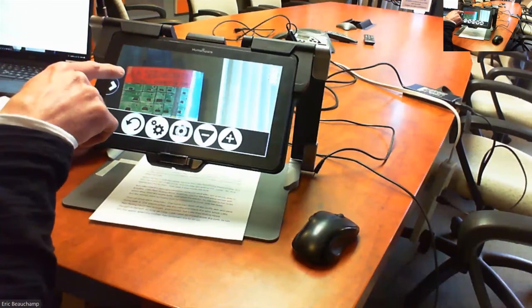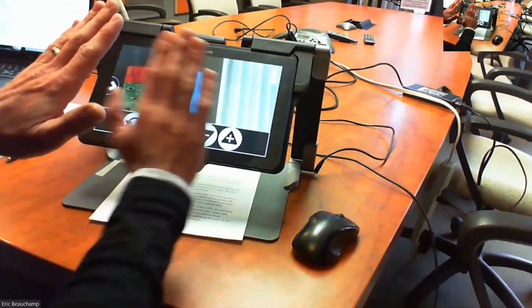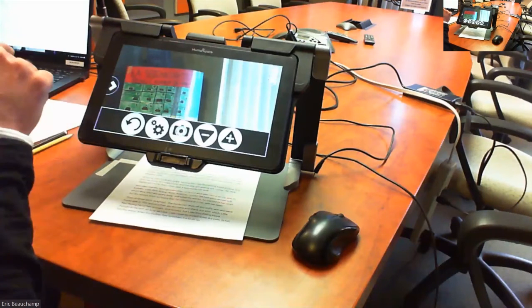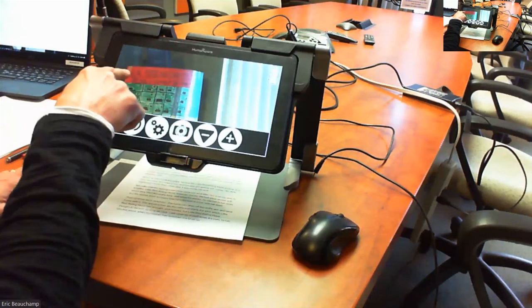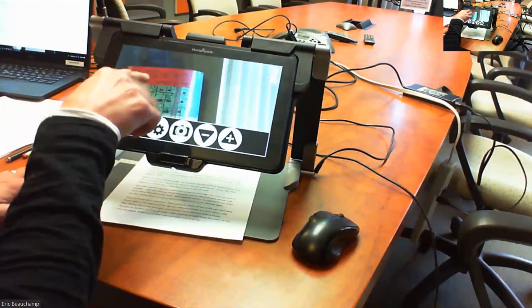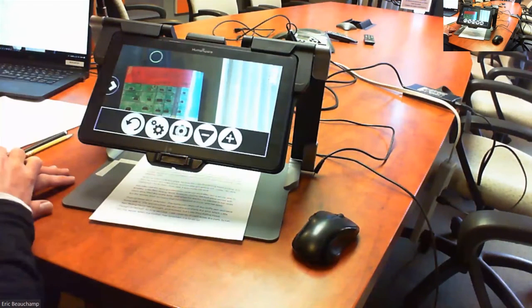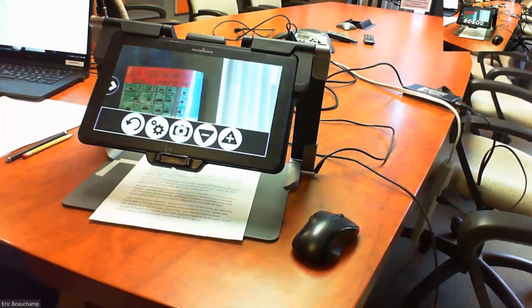And this is useful. Let's say you have something in front and in the back, and you want to concentrate your focus on the thing that's in the back, so you can really zoom in or really focus on that thing on the back. So for example, here I have one, my drawing here is in the front of the other one that's in the back here. I have a blue one. So if I want to just focus on the one on the back, I can select that, and the focus is going to be done on the one on the back. So you can see better what you want to see on the screen. So that was modified in the firmware for the camera.